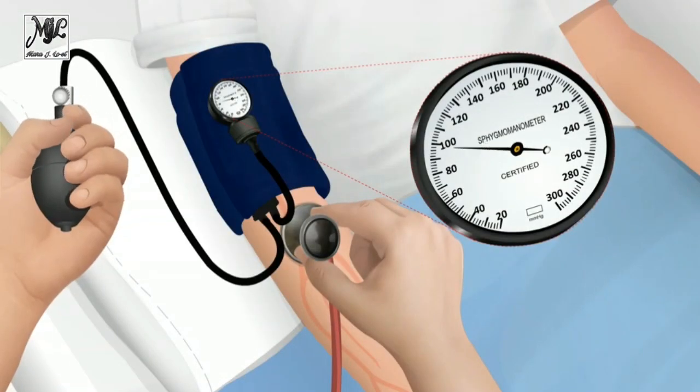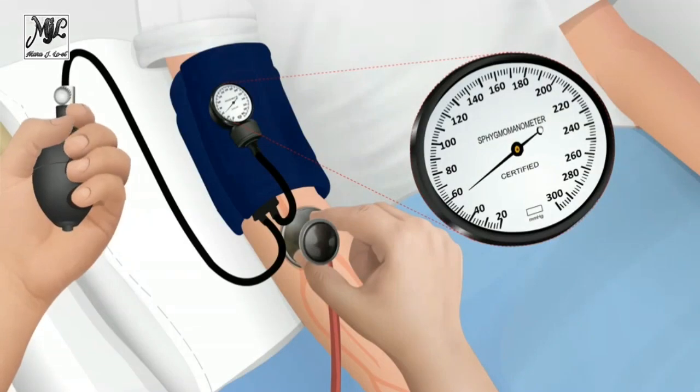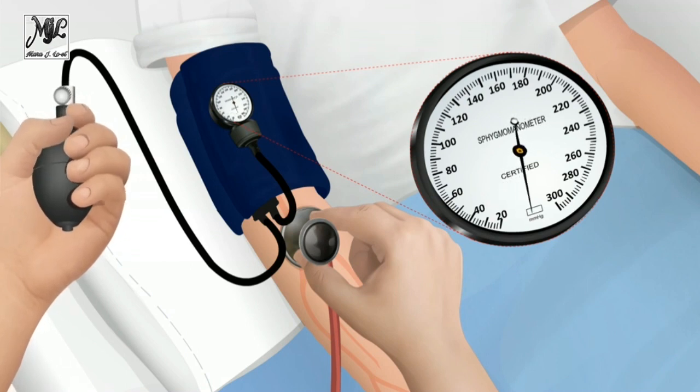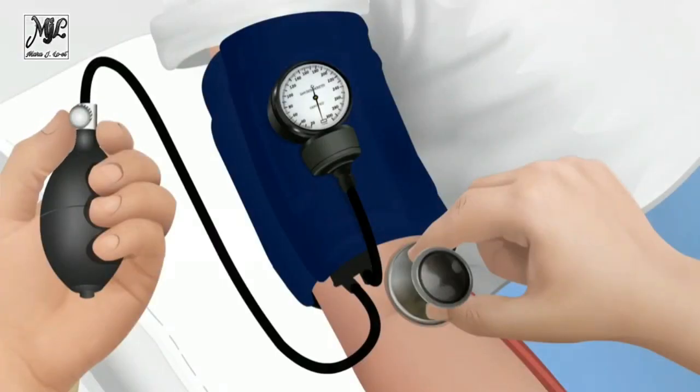Note the pressure reading when the Korotkoff sounds are muffled, K4, and when the sounds disappear, K5. Korotkoff sounds can often be heard through the entire period of cuff deflation. Absence of sounds, K5, denotes diastolic BP. After the last Korotkoff sounds are heard, continue to deflate the cuff slowly. If sounds are heard until the BP cuff is fully deflated, repeat the measurement with less pressure on the stethoscope head. If a very low K5 continues, record muffling of sounds, K4, as the diastolic BP.